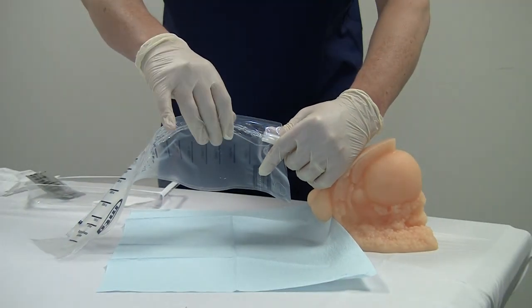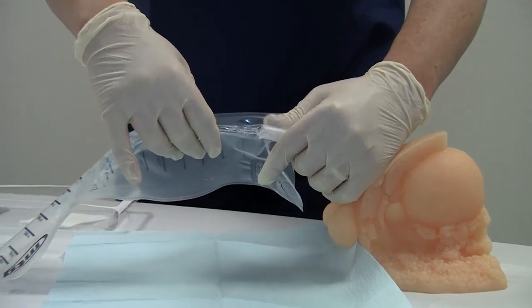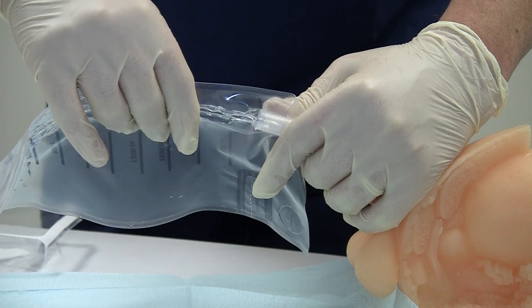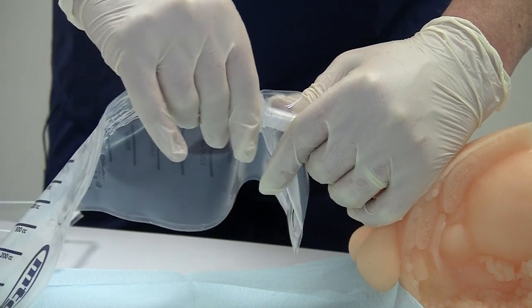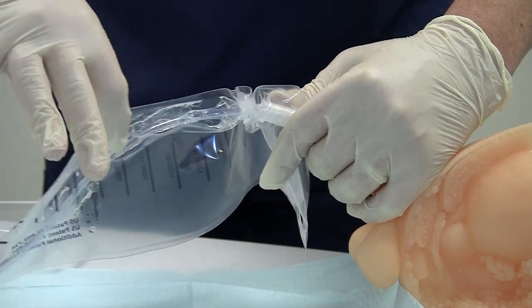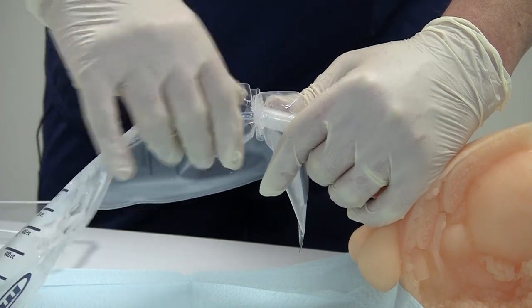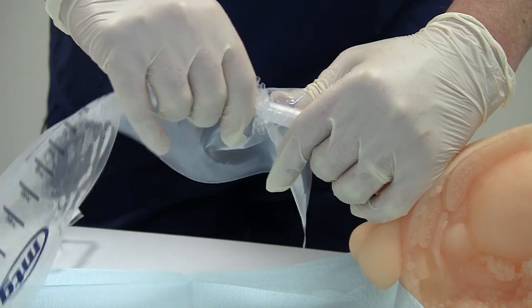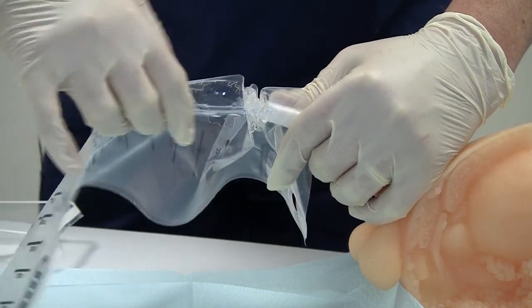And all I have to do now is go back to the catheter and the bag. The bag's graduated, and at the 1400 cc mark's about a good place to start. I'm going to advance the catheter at 1 to 1.5 inch intervals. Advance in. And again, I'm not squeezing anything because of that locking mechanism I described earlier. Notice how easy the bag is to push back. Insert in, straighten the bag, insert in, straighten the bag, insert in, straighten the bag.